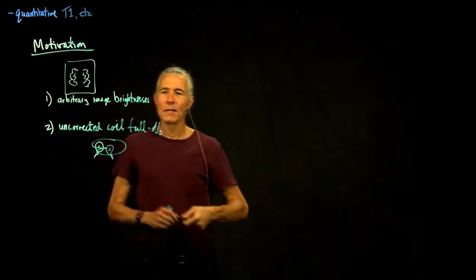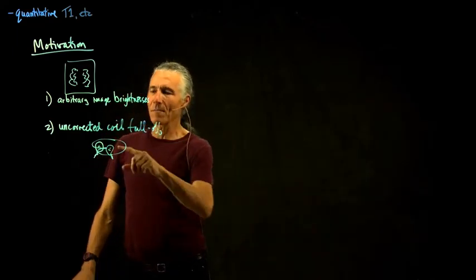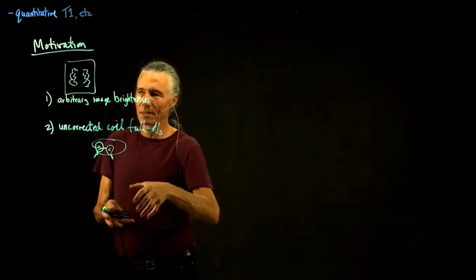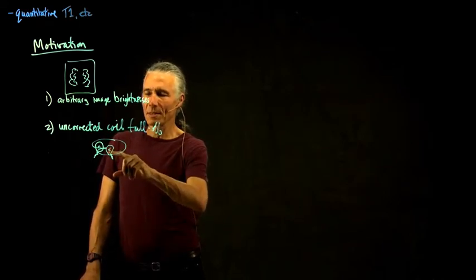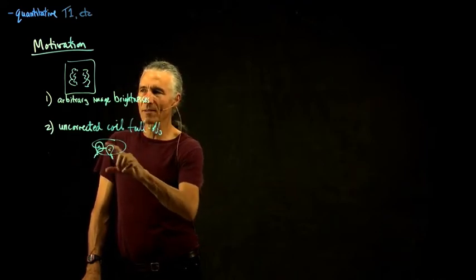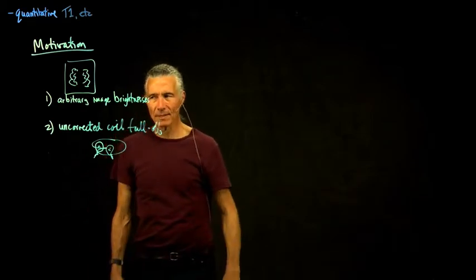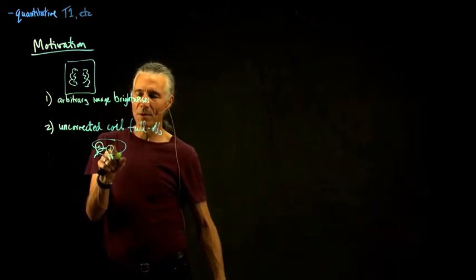As a result, if you're actually closer to the coil, the difference is bigger. So if you have a quadrature coil and you get closer to it, it doesn't make too much difference, because the pickup is relatively uniform. But the whole point of these coils, and the reason they have higher signal to noise, is that they don't pick up noise from other parts of the brain. And that's why the signal, which is the same as it would be for a quadrature coil, has a higher signal to noise. But that means that it's very sensitive to how far away from the coil it is.